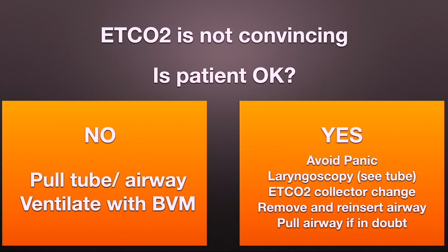Take a laryngoscope, look in and see the tube. If you have video, even better, take a picture of it actually sitting there. We can definitely identify and say, here's the hole that's the esophagus, here's the arytenoids, here's the glottis itself, here's the cords, here's the tube, here's the numbers on the tube, and I know it's in the right spot. If you do that, and you clearly see that, 100%, then okay, that's a pretty good tube.